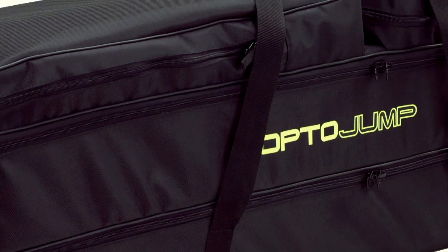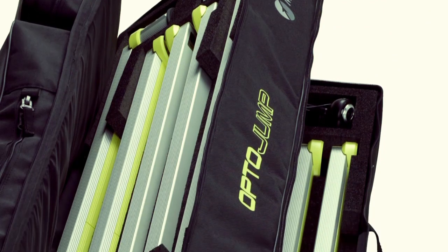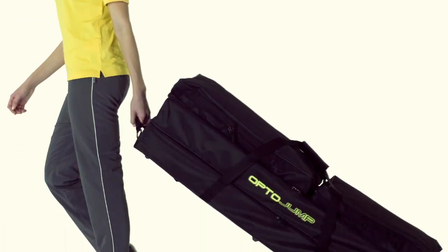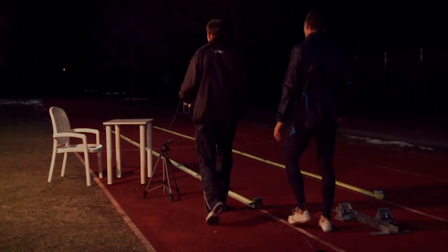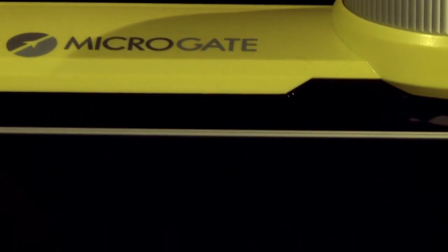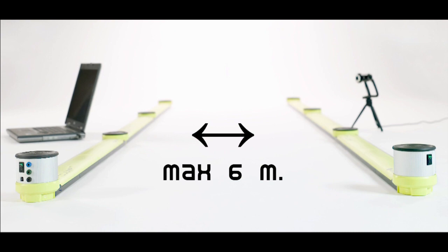OptoJump Next can be carried around easily wherever you need it, thanks to its lightweight design and handy bag. OptoJump Next is simple to use. All you need to do is position the bars on the ground, placing them opposite each other, up to 6 meters apart.